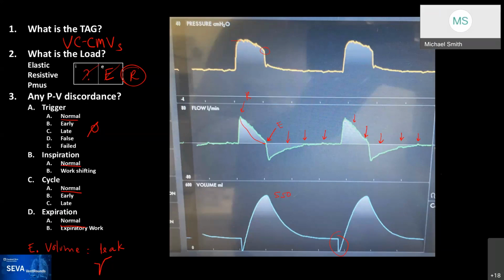So you're choosing volume? I'm choosing pressure. Pressure, all right. I have one person on the chat going for volume. Anybody else that wants to go volume or pressure? There's only two options. Have no fear. We'll give them a minute to answer. All right, there's equipoise here. We have volume and we have pressure coming through. Rob, do you want to give it a shot?